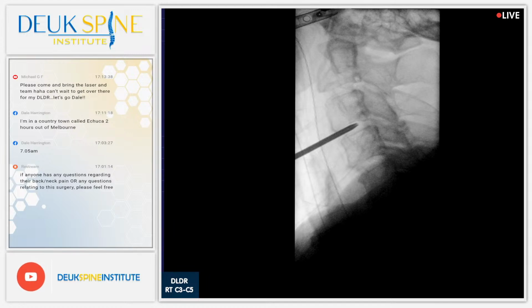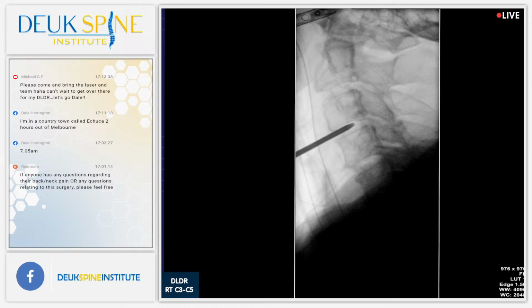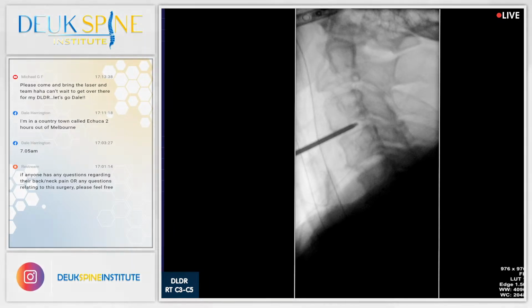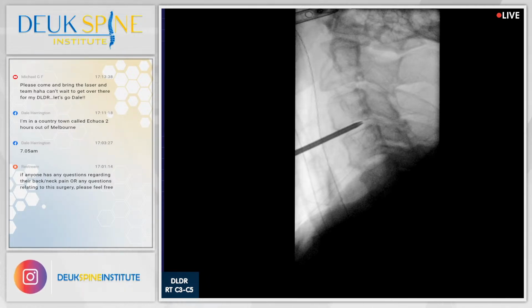Shot? Shot? That's it? Nothing coming out. That means he's got a lot of scar tissue here. Nothing? All right. Well, I couldn't get any dye out because the disc is too scarred up from inflammation. Wow, man, that's incredible.